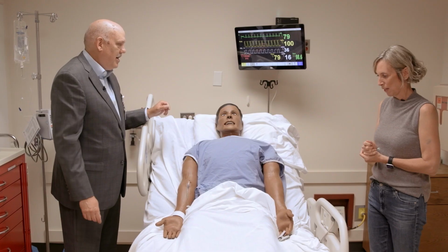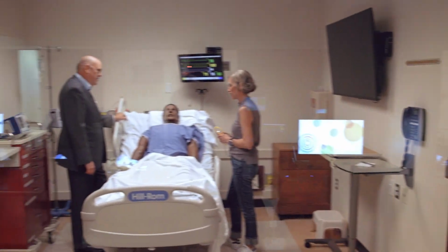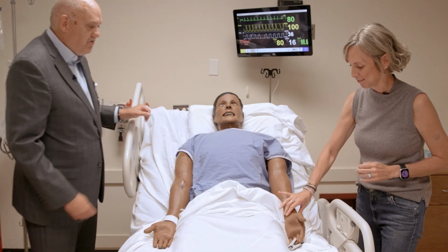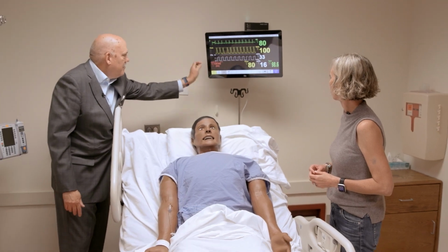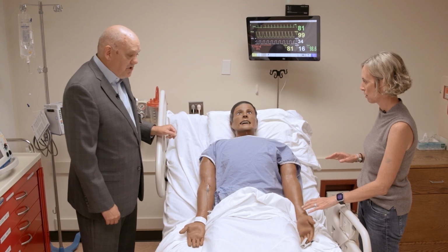So Julie, this is a device called a human patient simulator. It's a sophisticated computer, and my colleague James is in the control room and he is portraying the patient. And he is breathing. Yes, he is. He's breathing and he's blinking and he has some limited movement. He has pulses. You can feel his pulse at the wrist, right where you would normally feel your pulse. And he has vital signs up on a monitor here, just like the patients in the hospital have. I've never seen anything like this. What else does he do? I see him blinking, I see him breathing, he's got a pulse. So he has all the normal vital functions that you and I have, just in a different looking package.